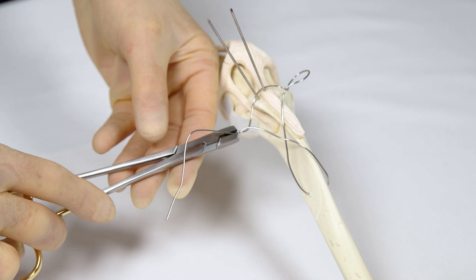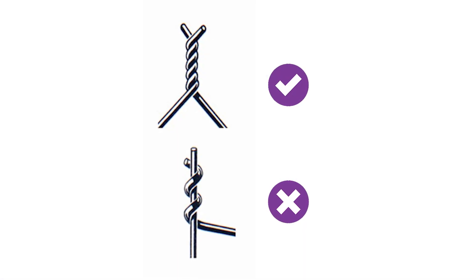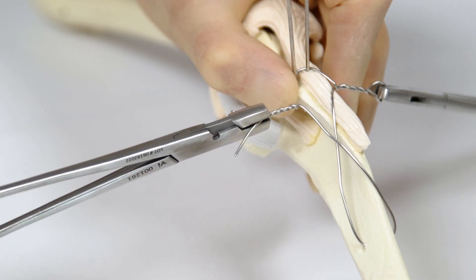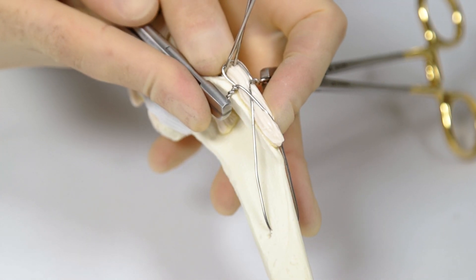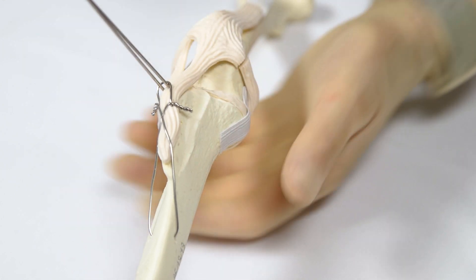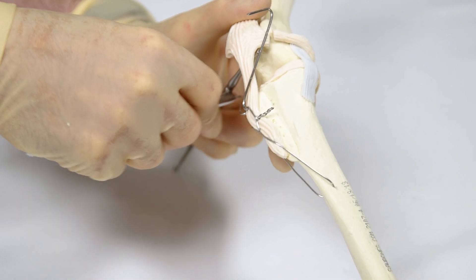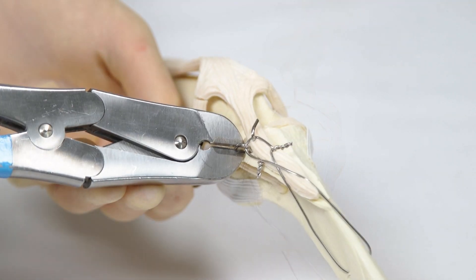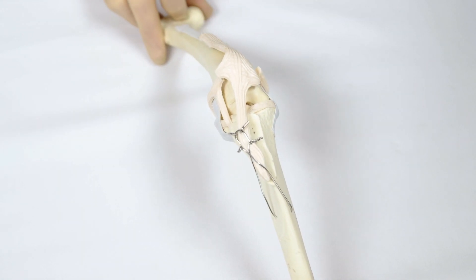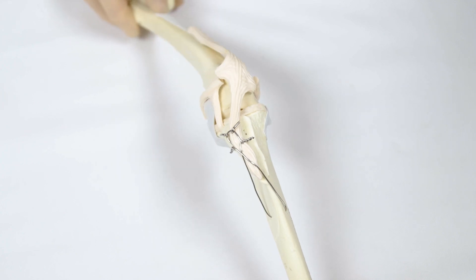Using two wire twisters simultaneously to tighten the tension band will assist in achieving even tension. Ensure the wires twist around each other, not one around the other. The figure-of-eight tension band should be completed with a lateral and a medial twist, cut to length and bent over alongside the tibial tuberosity to ensure no interference with soft tissues. The K-wires are bent proximally, cut down to an appropriate length and twisted to a position where they do not interfere with the soft tissues. Once the tibial tuberosity transposition procedure is completed, patellar stability is further tested through a full extensive range of stifle movement.